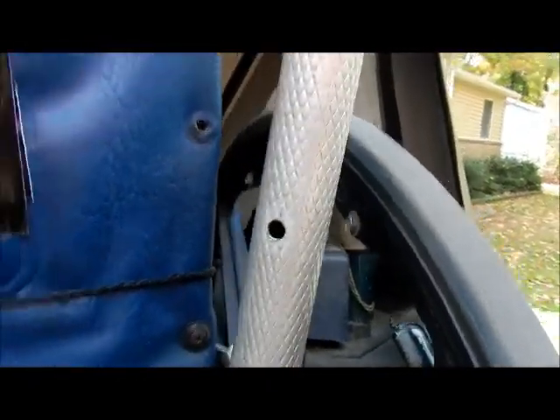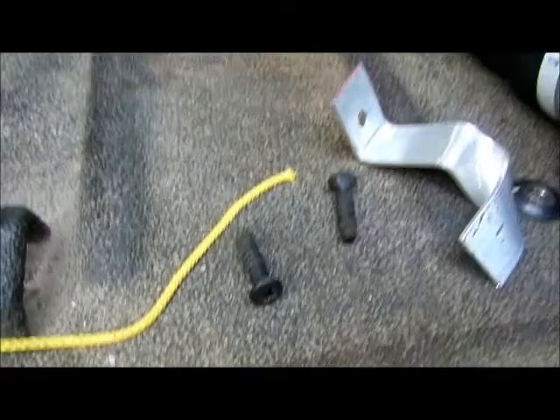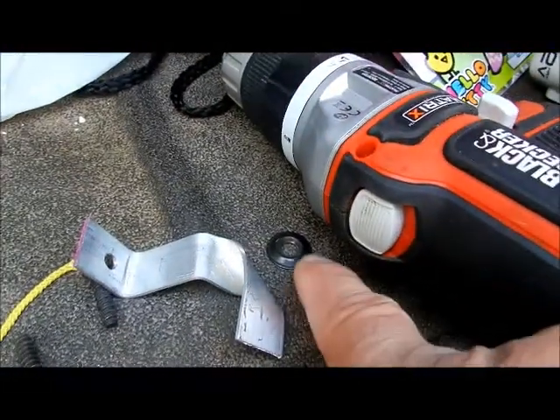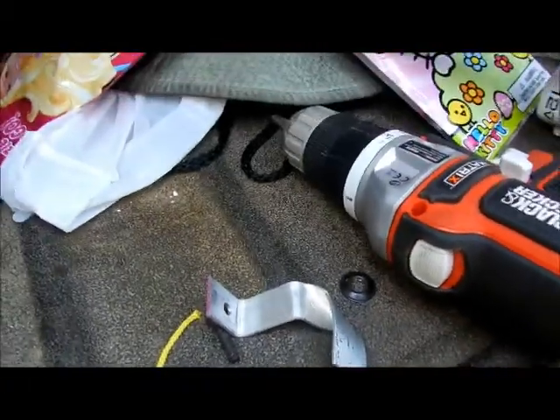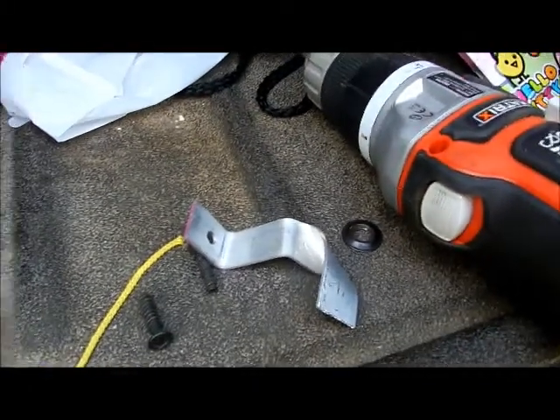There's a hole on the bottom — I'm going to show you what I did with that. I've already taken out the two screws right here. They are long enough, and I've already made one of the brackets and tested it. The screws are long enough to go in there, but make sure you don't lose this piece when you take them off. I did — I don't know where it is. It's probably inside my bumper here, so try not to lose those.